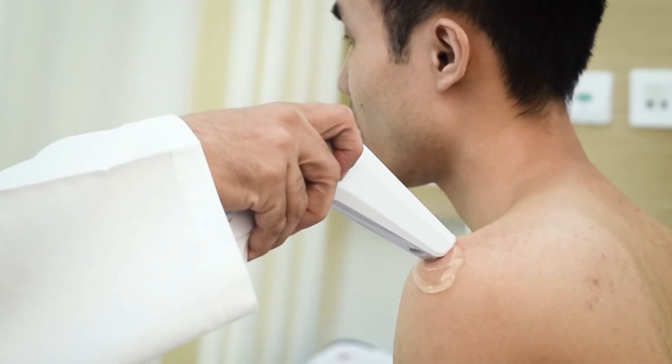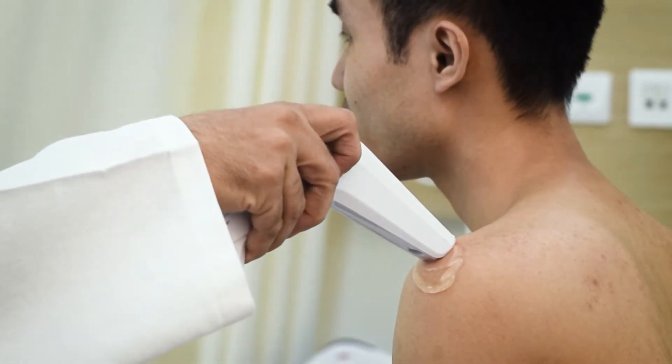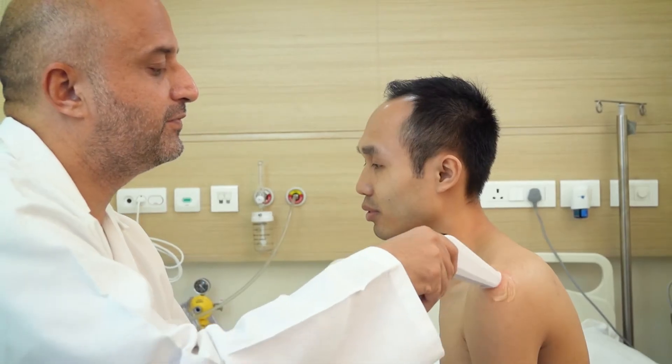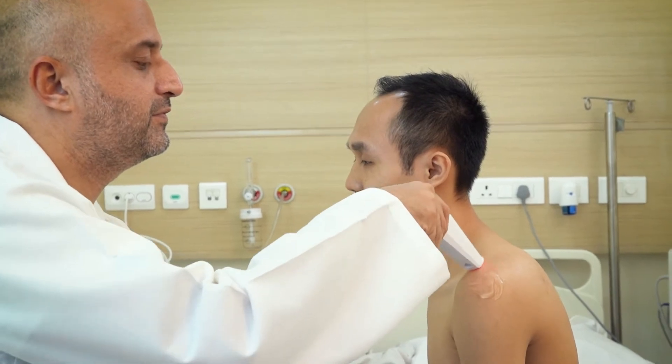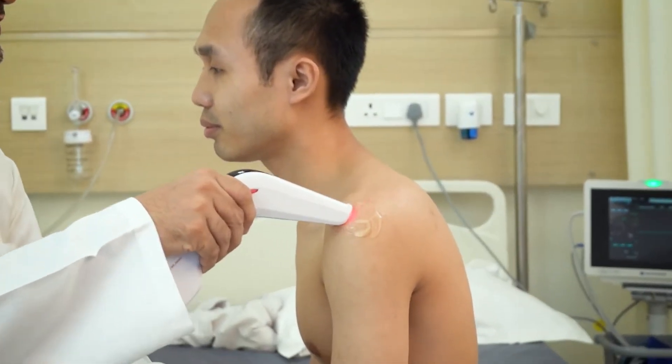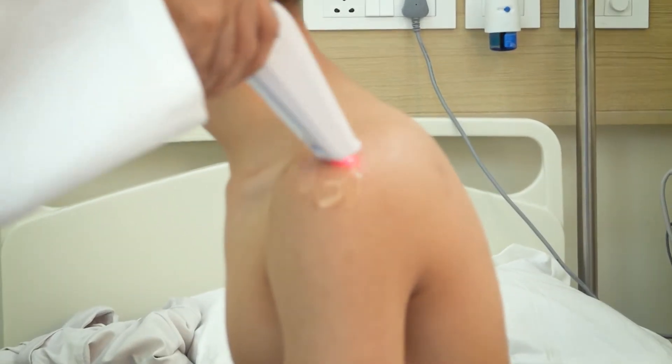Slowly rotate the 360-degree wheel to activate the GT photonic cold laser and nano molecular biostimulation. Increase the intensity of the biostimulation until the patient feels a needling or prickling sensation. Do not keep the intensity too low or too high.